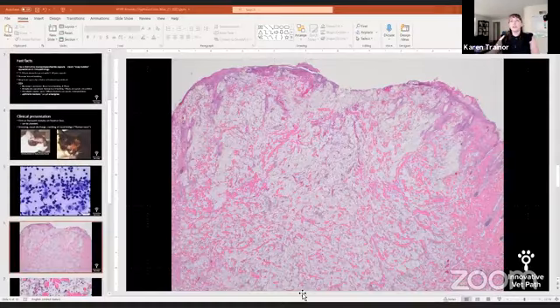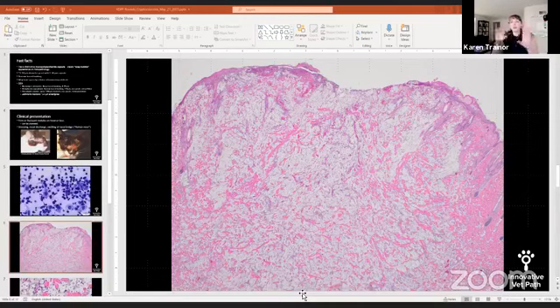And so here is our histopath slide, and this is an example. We're looking at, of course, haired skin, and here we have the normal haired skin. This is from a cat. And then we just see all of this white with lots of sort of purple dots everywhere.